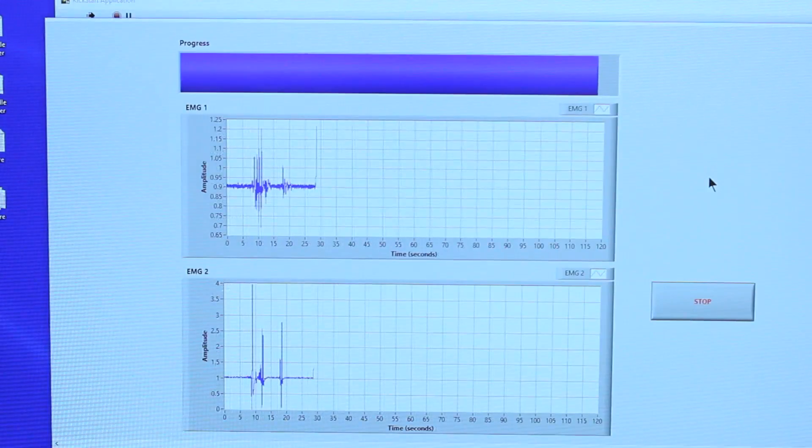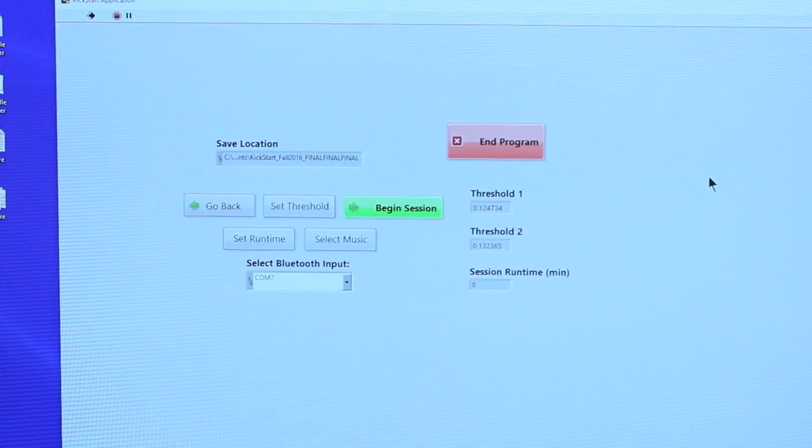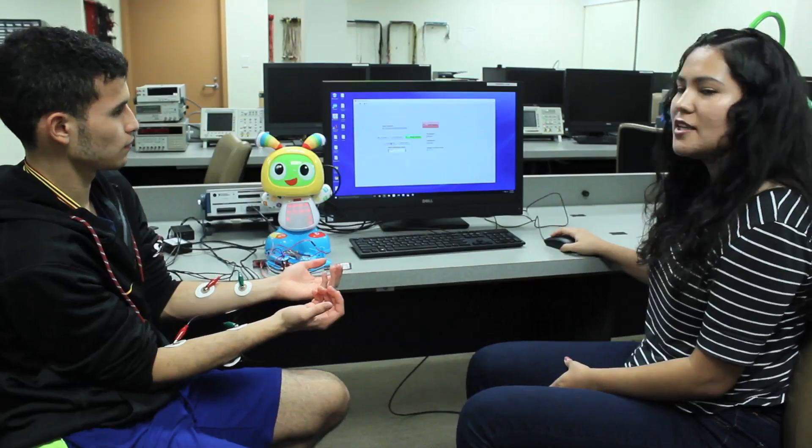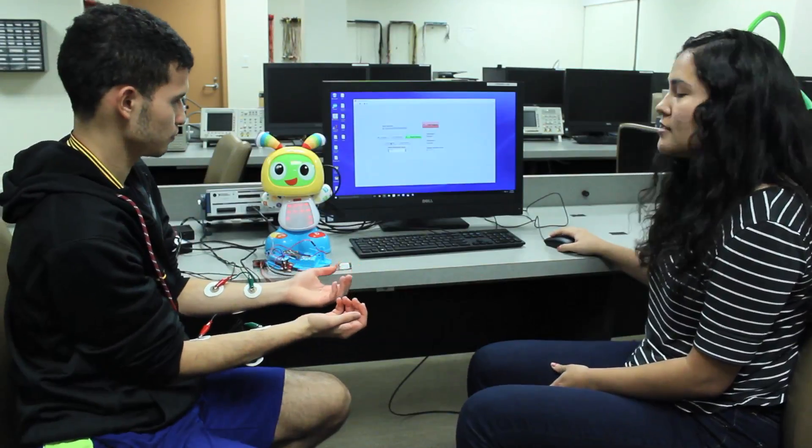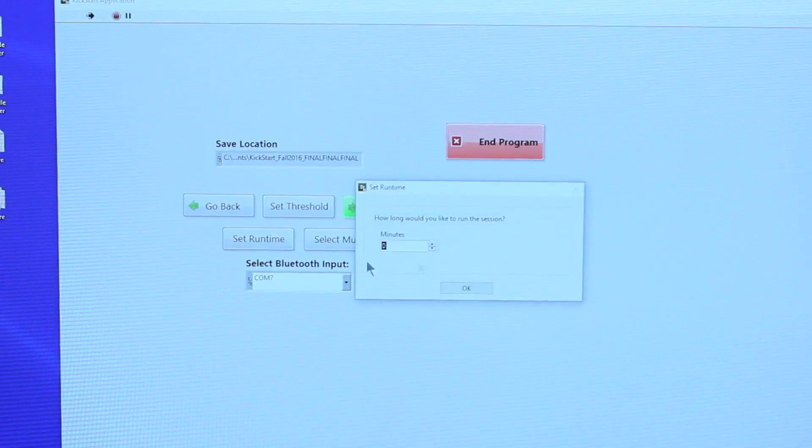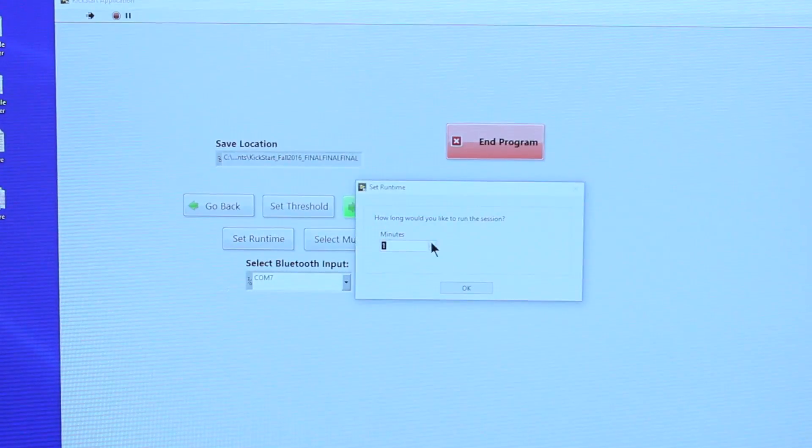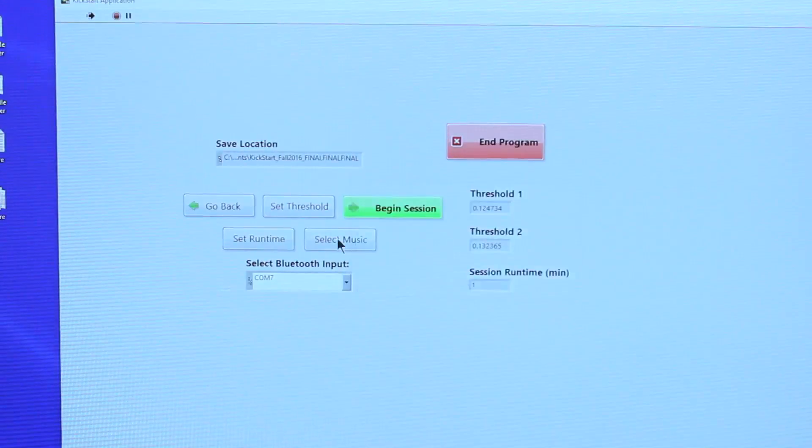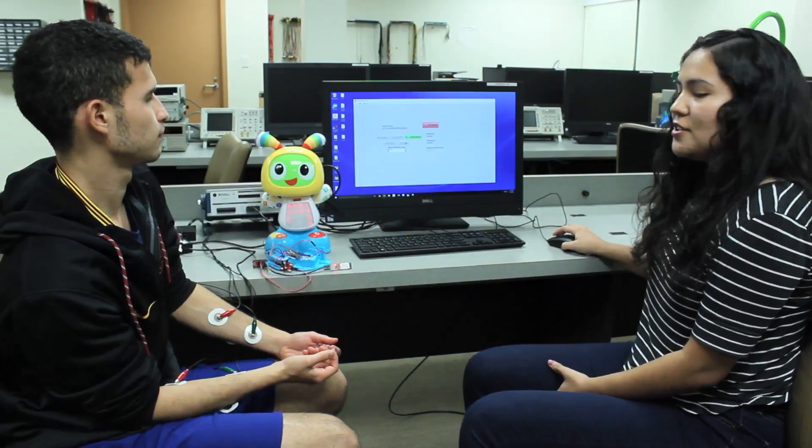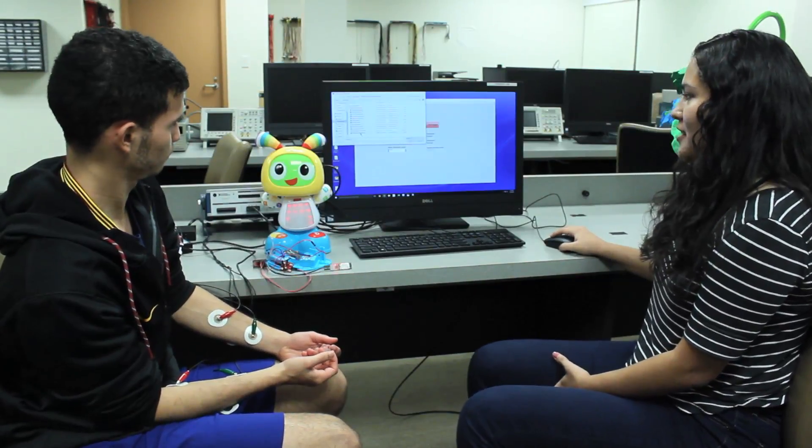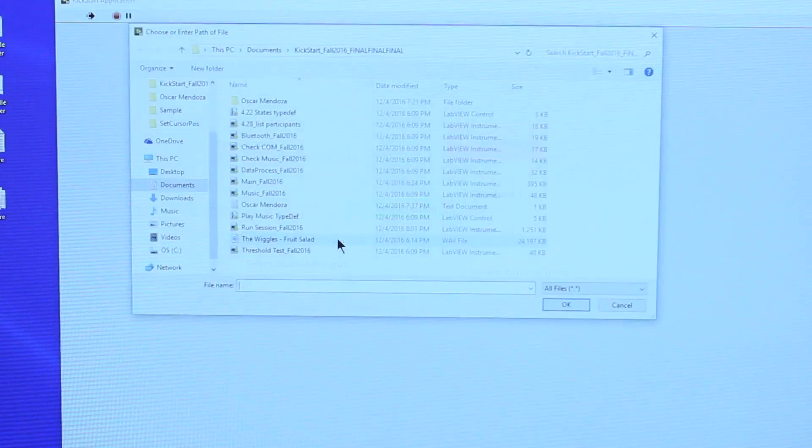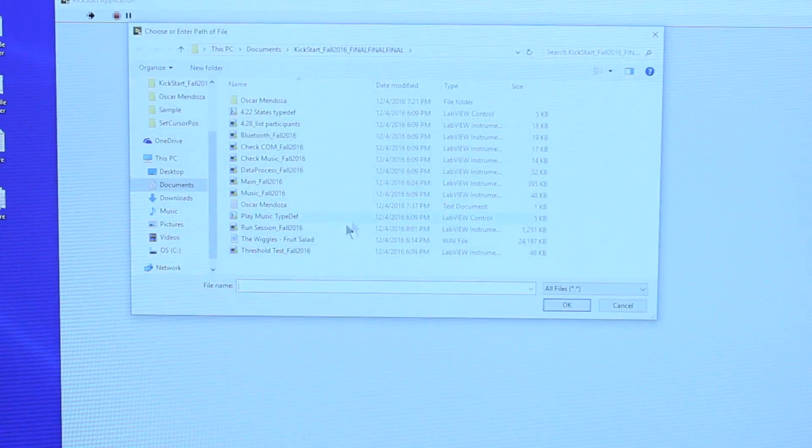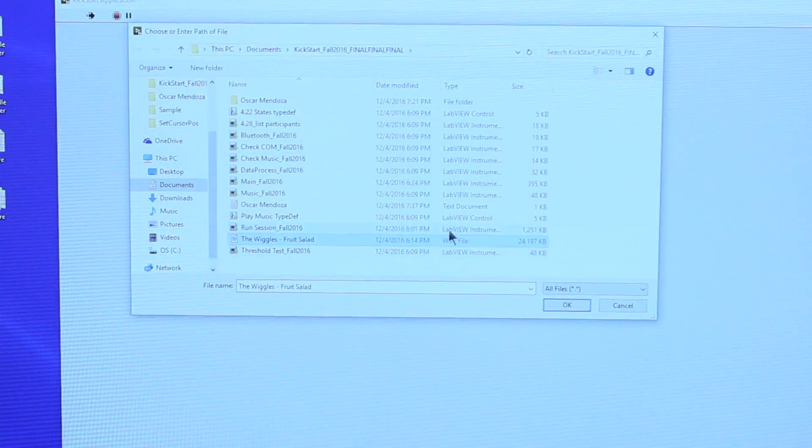Now you can select the run time, how long the session should last. For this example, we're going to set it for one minute. Next thing you do is select the music that you want to play during the session. Make sure it's a .wav file, or else you won't be able to play music.